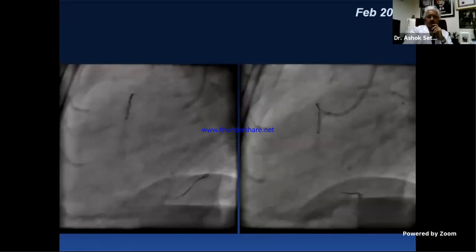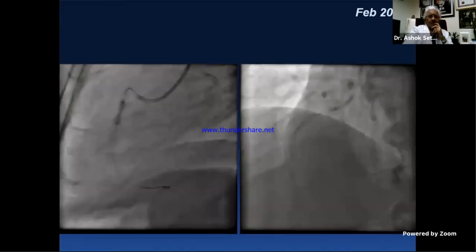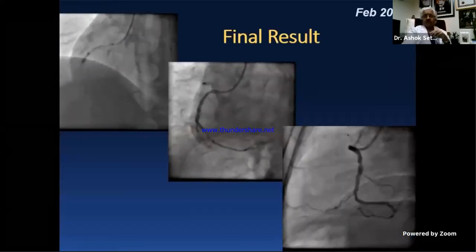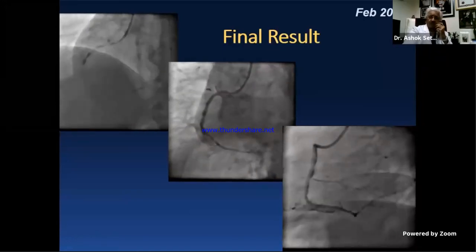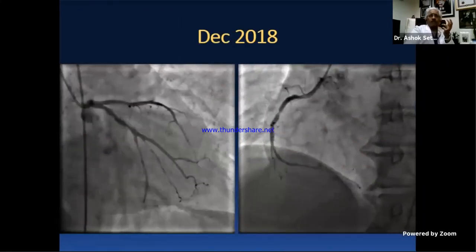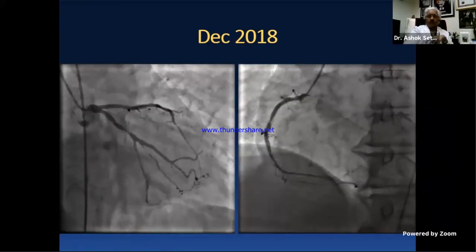So a third stent goes in, now covering the under-dilated lesion. The operator still tries to dilate that lesion after having implanted a stent into it, and this is the residual stenosis, as expected. The patient also has a circumflex lesion, which is not attempted because this residual stenosis with three stents is not considered a big deal. You can also see the vessel is small. It's certainly not been treated well, but of course, this is the circumflex stenosis. Now, it comes back in December 2018. This is where we have the advantages now.